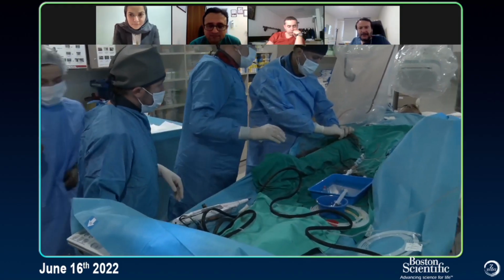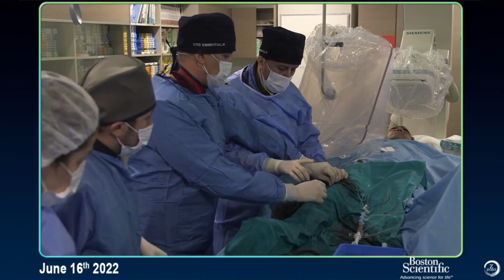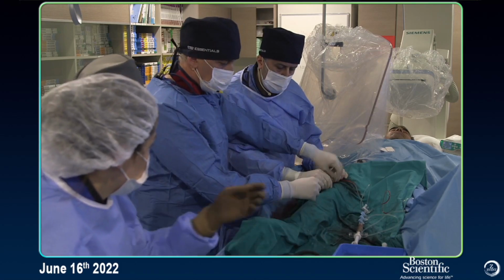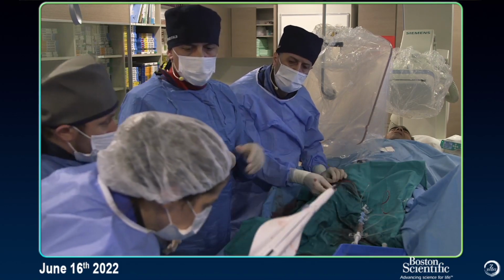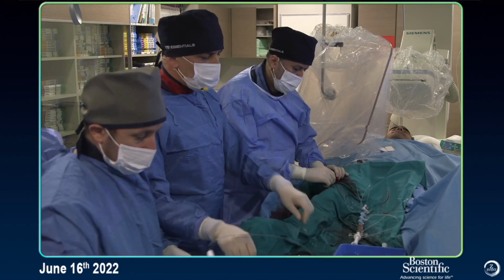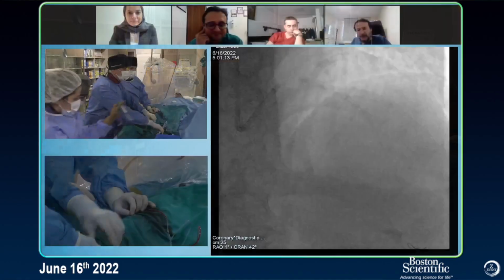Everything I am mentioning has happened to me. That's experience. I can also give you some insights about my stucks. I had a lot of stucks, microcatheter, trapped balloon. So we have now, let's do one injection. Everything looks okay, but let's check it again.